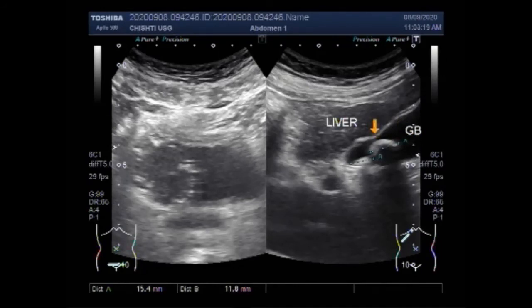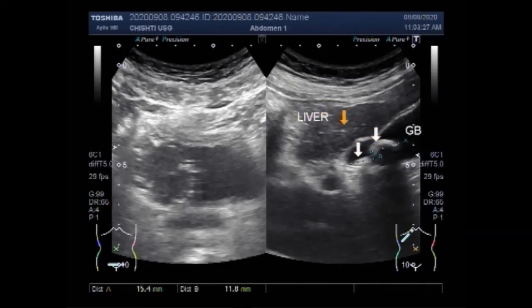Bladder ultrasound can show how much urine the bladder holds when it is full, and whether someone completely empties the bladder when urinating. Bladder ultrasound is often done along with an ultrasound of the kidneys.